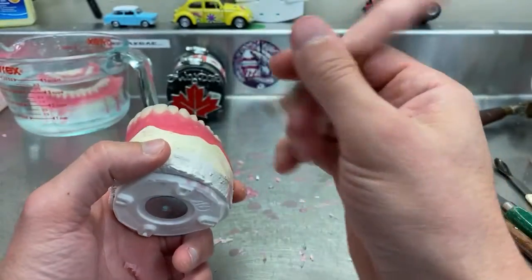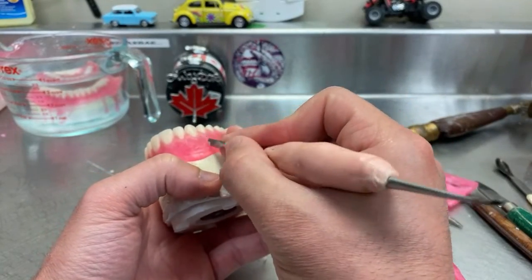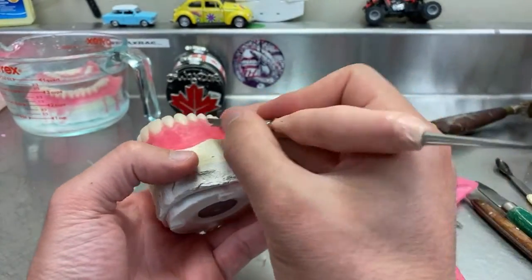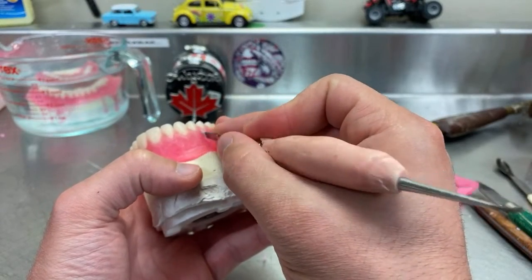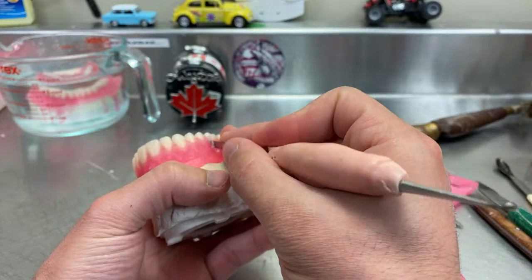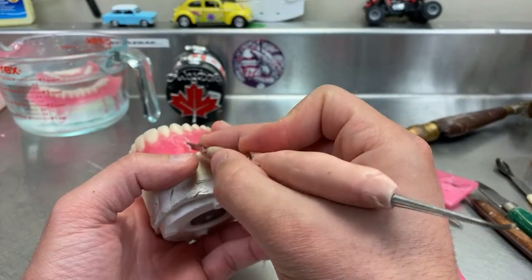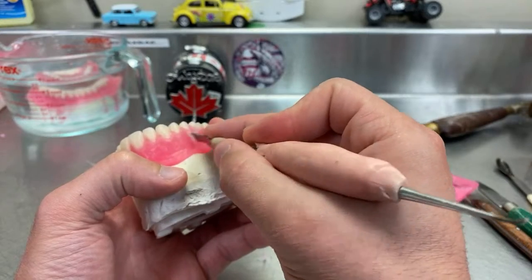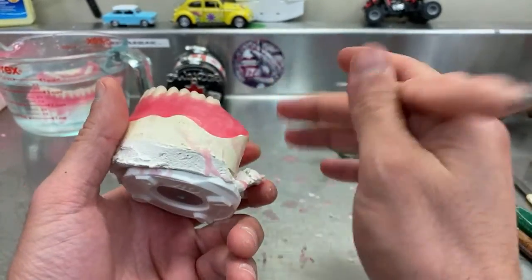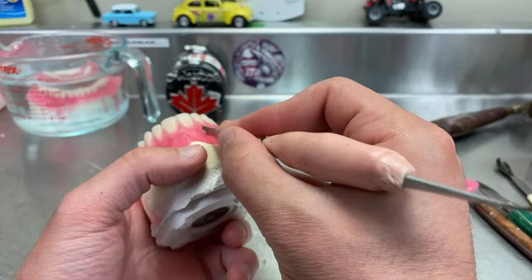I see a lot of people go with carving an actual line around the teeth, and I'd say it's a bad idea, because your wax is already making that natural look. And I'll show you what I mean. Look at your teeth in the mirror and you'll know what I'm talking about. There is no actual line that starts the gingival roll. That's another thing that you guys should work on if you're a student or going to be working soon. Look at a lot of healthy gums, different ages, nationalities, genders. So by doing it that way, I'm actually eliminating creating that line.